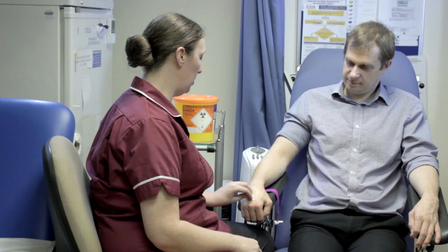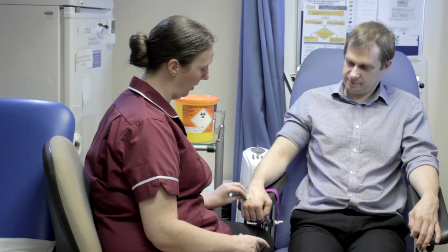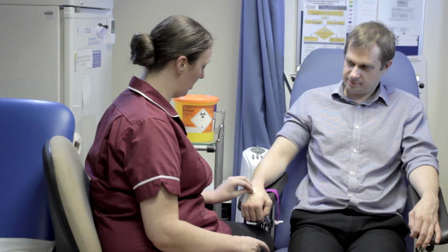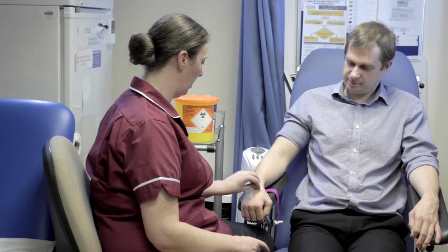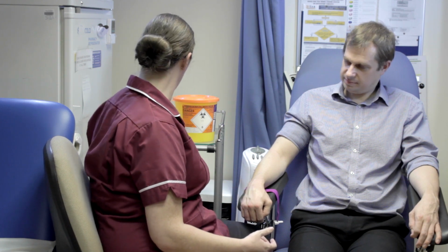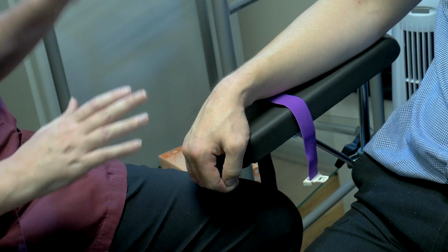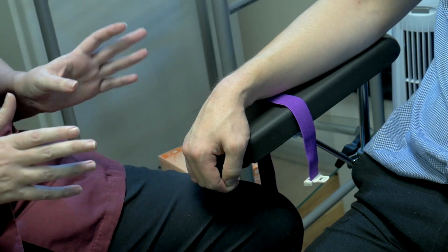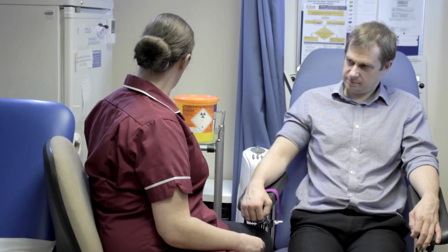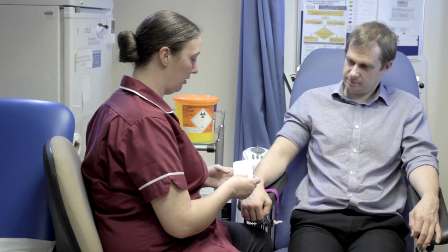And what this does is it pushes the bacteria on the skin away from the site that we're taking blood from and cleans them sufficiently that we have a choice for areas that we may want to perform venipuncture in. Whilst that's air drying, and we do need to leave it to air dry for quite a long time, it can be up to a minute. So whilst it's air drying, I want to prepare my needle.